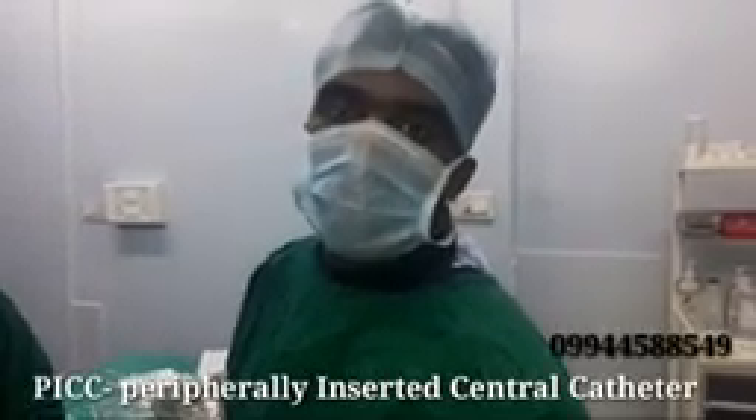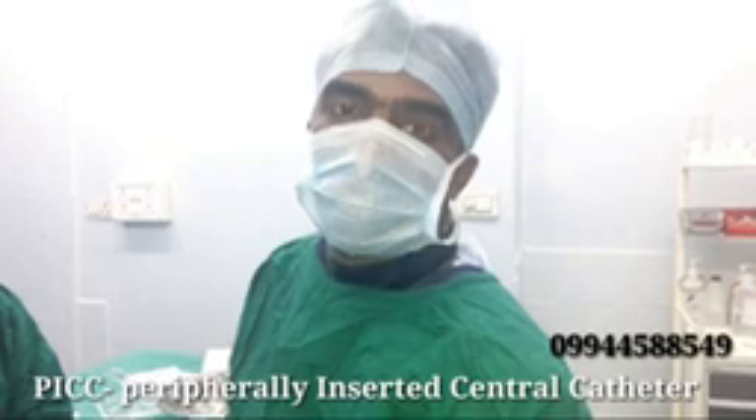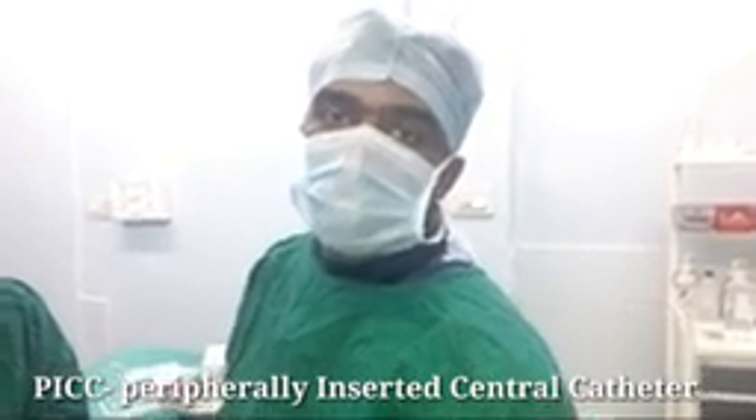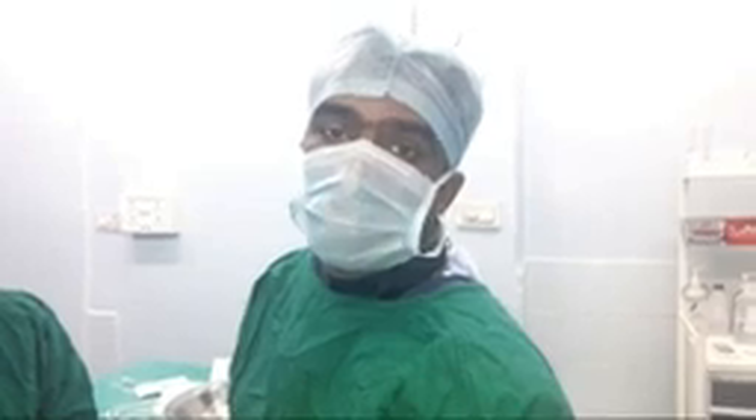This is Dr. Shailesh Kumar Gargay, Vascular Intervention Radiologist. Today I will demonstrate a case of PICC line placement in a patient who needs long-term antibiotic therapy.